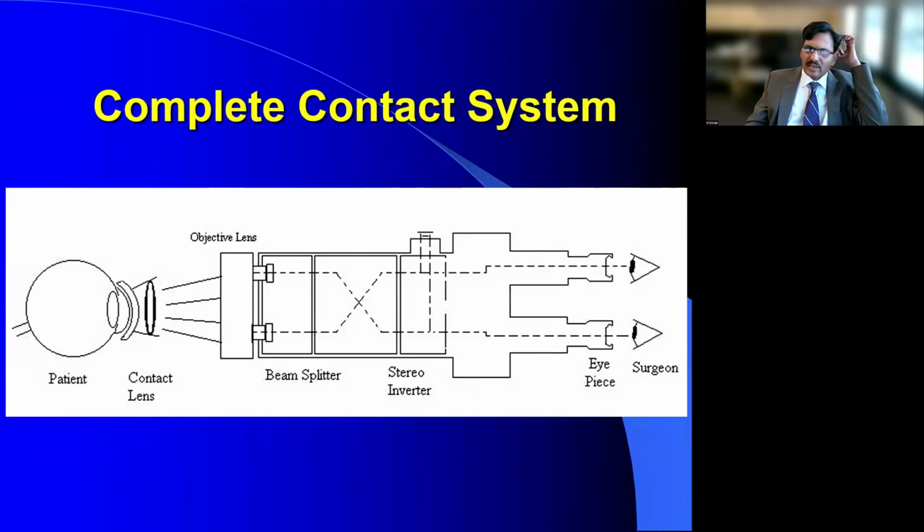There are two other points that I need to mention here, in terms of the focus and also in terms of the zoom. Remember, your microscope has a zoom capability varying anywhere from 4x to around 12x. So you're trying to magnify. If you use less magnification, you see more of the area. Use more magnification, you see less of the area, but more of the stereopsis for you to do surgery at a micron level. And this is crucial to understand. And the more you're familiar with it, the better your surgical results are.